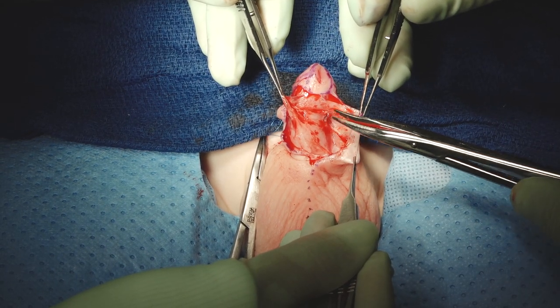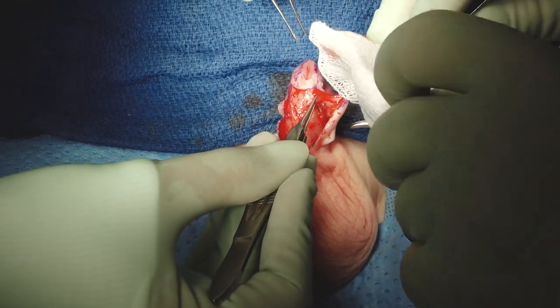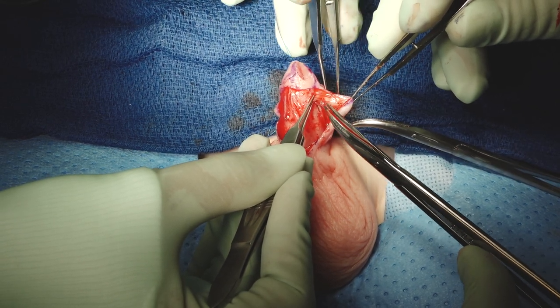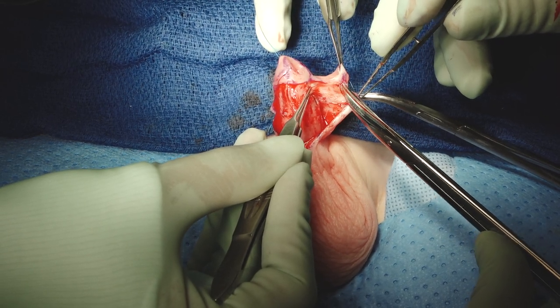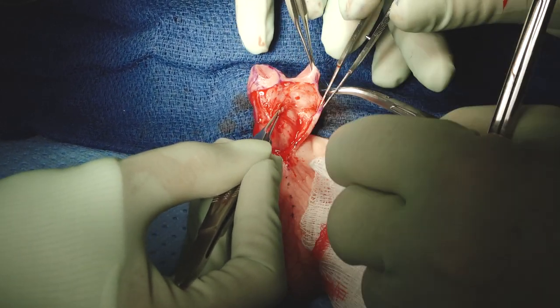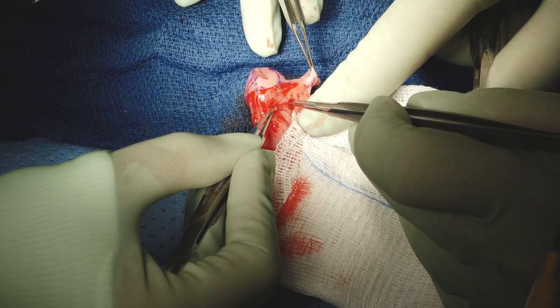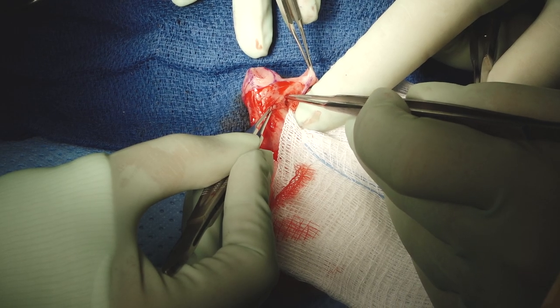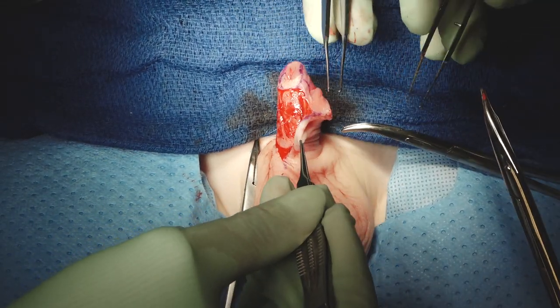This view gives us great exposure. This is the same way you would approach a penis for a foreskin reconstruction. We know many of you don't do that, but it's so easy — and many parents want it. We've published that the complication rate is no higher for urethroplasty or skin complications than if you do it with a circumcision. Our goal today isn't to convince you about preputioplasty, just commenting that it's the same beginning of the operation.